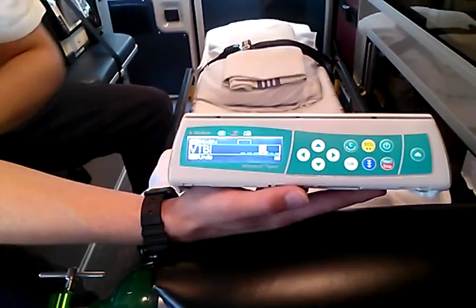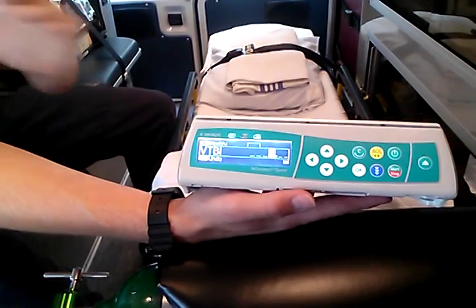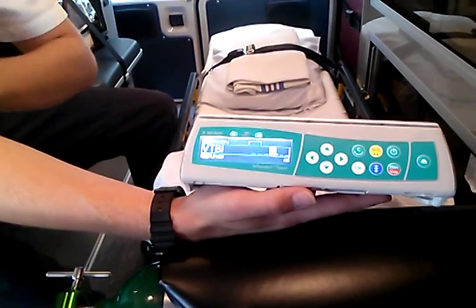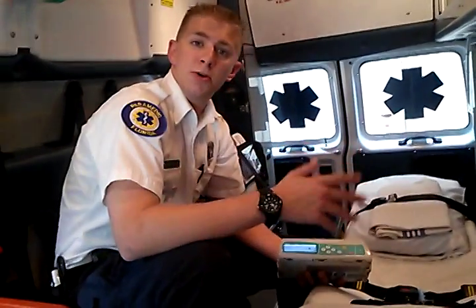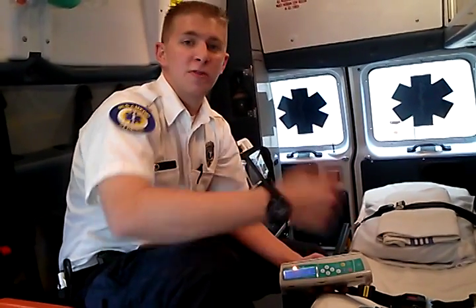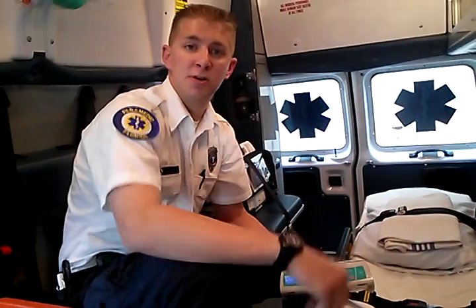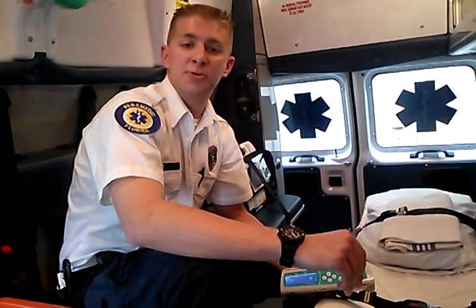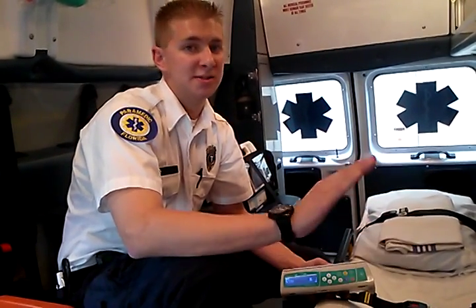The first thing that pops up will say VTBI, which stands for volume to be infused — so how much fluid are we putting into the patient? If the patient's on a 1000 mL bag and you've got to do the whole bag, your VTBI will be 1000. Likely when you pick the patient up, they're already on a drip and some medication has already gone in. If they're on a 1000 mL bag but 200 cc's have already been infused, your VTBI will only be 800. You can look at the hospital pump to see how much has been infused, do some quick math, and know you have 800 more to put in. That's about as complicated as the math gets.